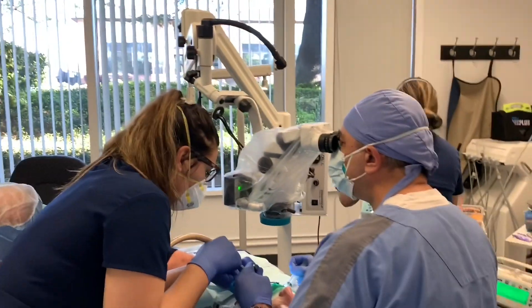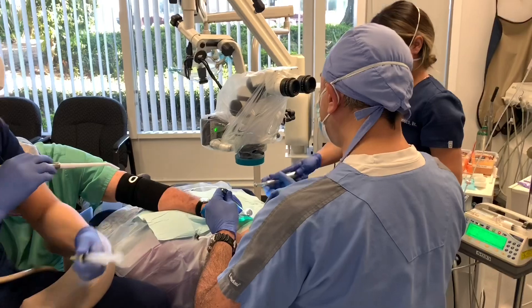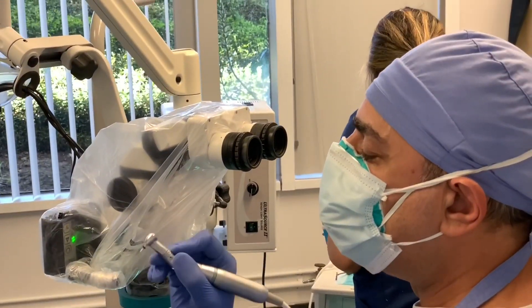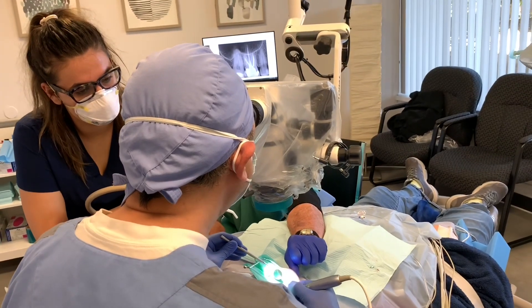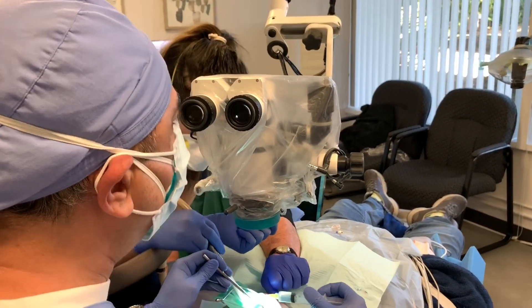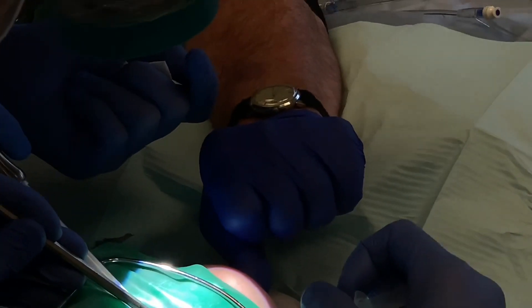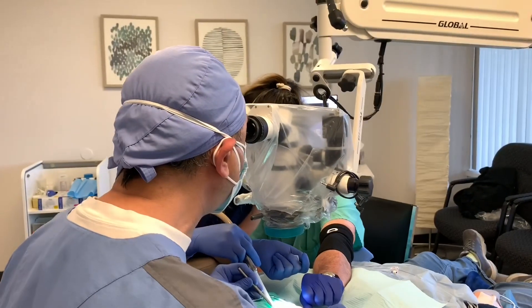In the distobuccal canal my flare file didn't want to go to the full length of 22 millimeters due to the taper. So I used a regular stainless steel size 20 K-file to establish that length — and the 20 goes with ease. Now that the stainless steel 20 went to length, my flare file should follow. If it still doesn't want to go, I won't force it — I'll go to 25 first, then try the flare file again.